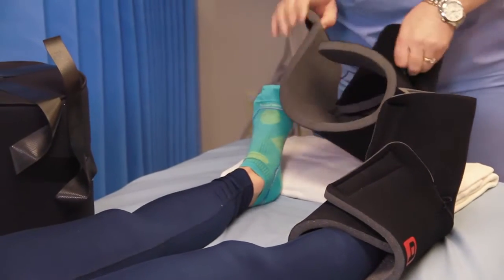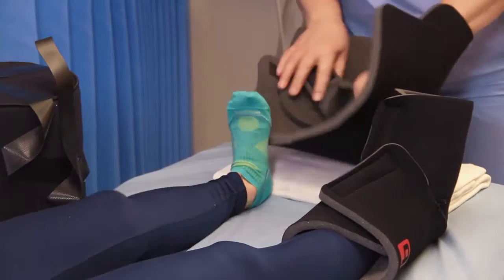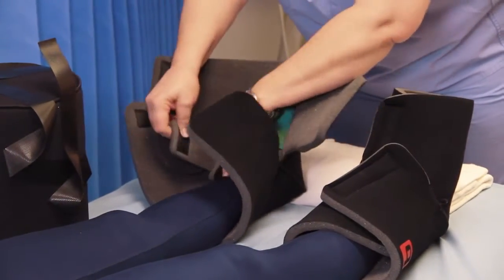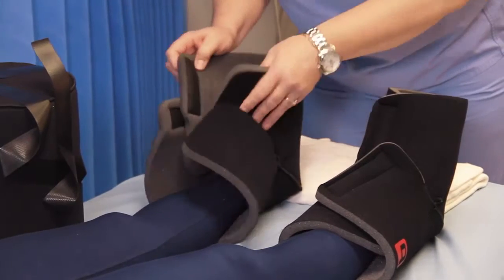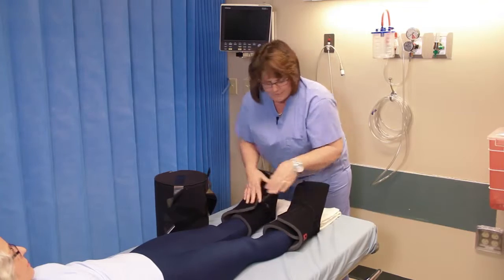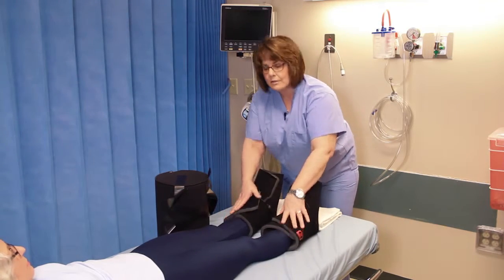We'll do the same on the other side. Have you get your foot right in there. Secure the ankle part first, the forefoot, and then the top part. Again, the red logo is on the outside of each lower leg.